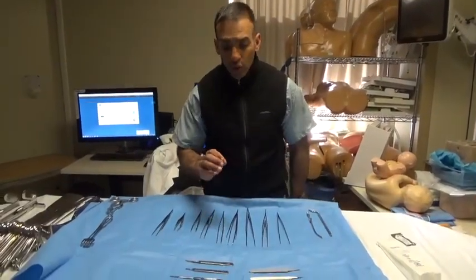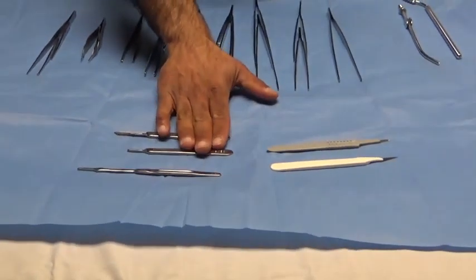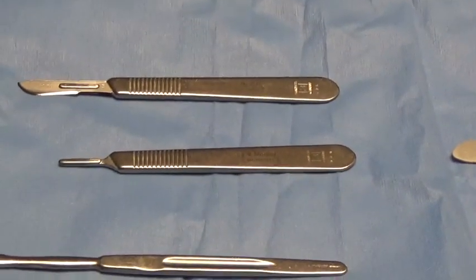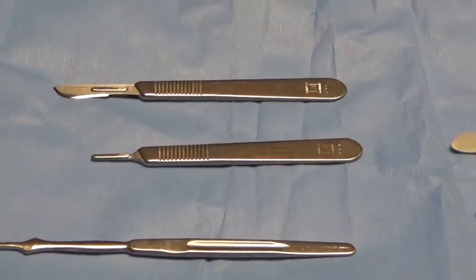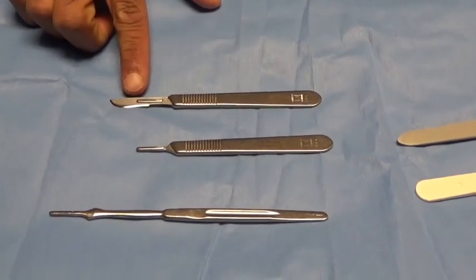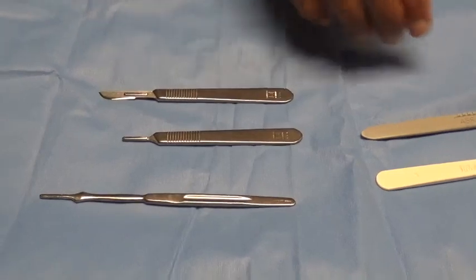The first instruments we'll go over are blades and blade handles. There are generally two different types of blade handles in these sets. We have two number three handles. Number three handles are designed to hold any type of blade configured for them. The most common blades from a general surgery perspective are really three. There's a number ten blade used for large incisions, with a broad beveled tip designed for large laparotomy or thoracotomy incisions.